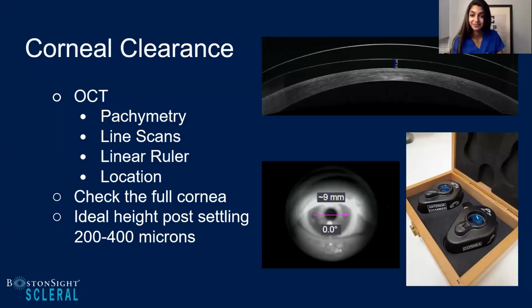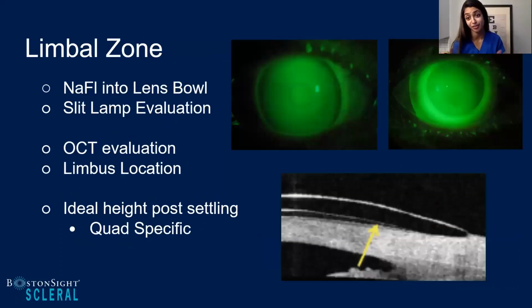I think my goal is to monitor closely when you're dealing with these corneas and make sure that whatever height you have, you're not doing any harm, and that you don't end up with any touch. Yeah, and I think that's a great point. So why we're even giving this lecture is how to monitor and identify it.